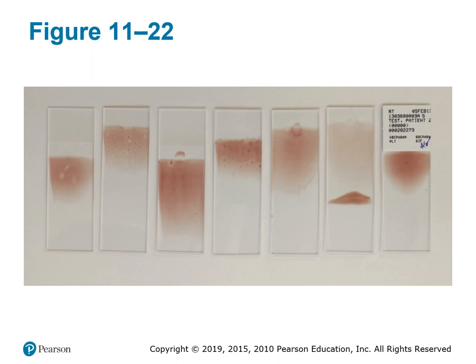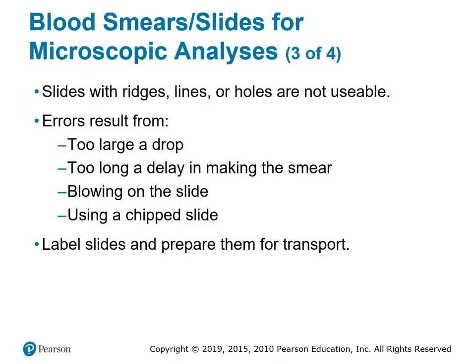Errors can occur with a microscopic slide: if the drop is too large, it won't smear correctly and the cells will be too thick to differentiate clearly. Another error is delaying too long before making the slide — if the drop has started to dry, it won't smear correctly.